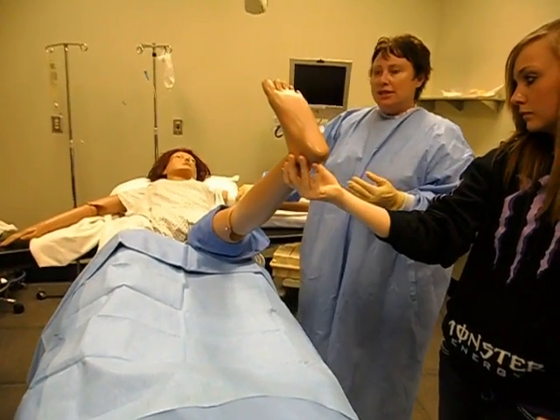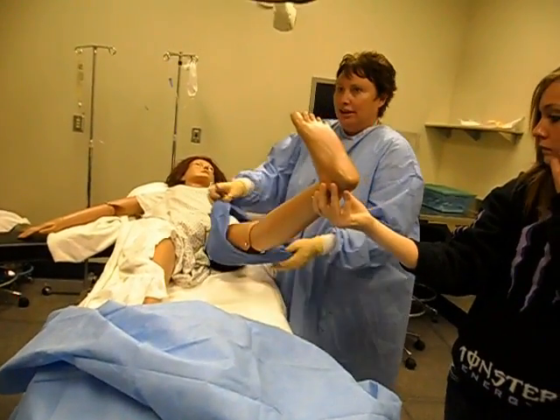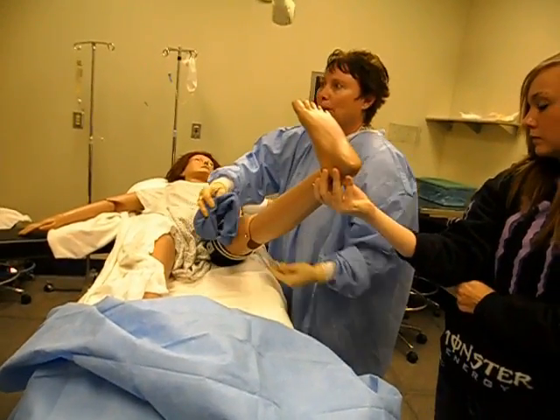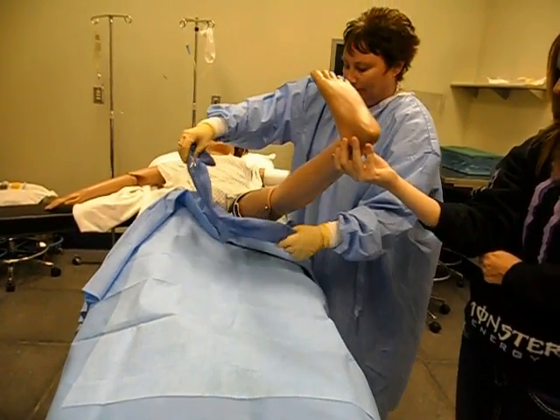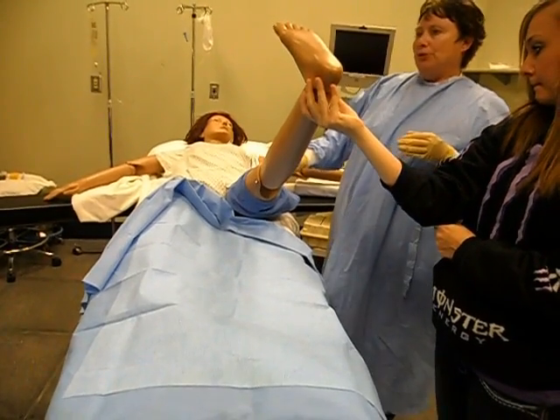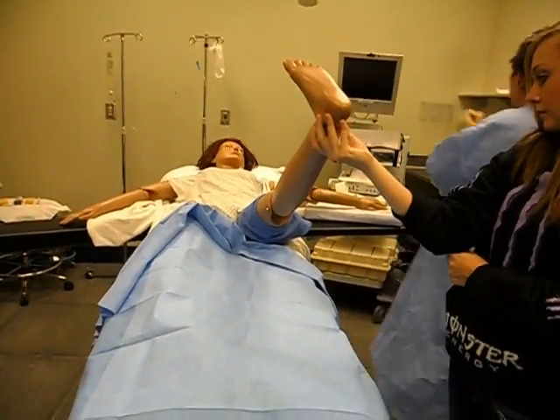You can see why this sheet is very handy. If this sheet wasn't on there, this is all non-sterile and I run the risk of bumping it. So it's just added protection — it's nice to have. Lift up a little higher so I can get this around the tourniquet, and we'll clip it. You could use a perforating or a non-perforating towel clip — it didn't matter.